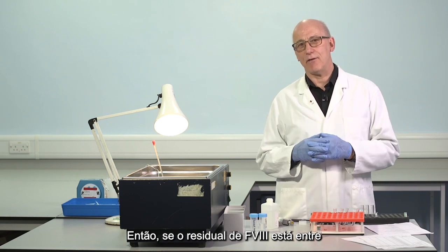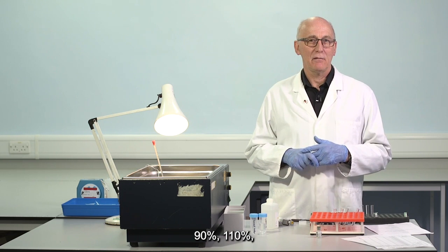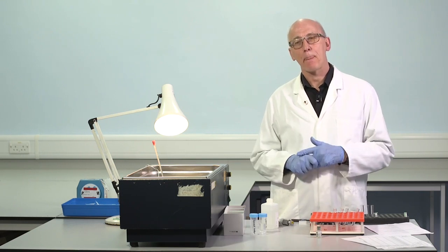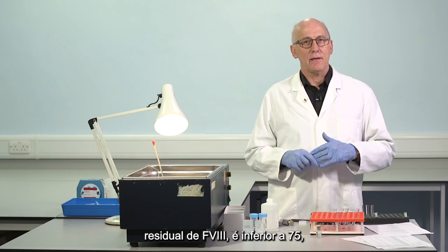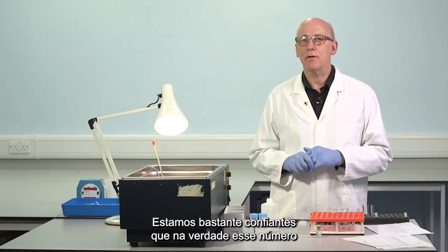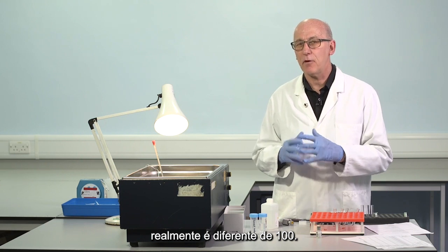So if the residual factor 8 lies between 90% to 110%, we're confident there's been no change relative to the control mix. 0 antibody, negative. We know if the residual factor 8 is below 75, 70%, below this kind of level, we're pretty confident that actually that number truly is different from 100.